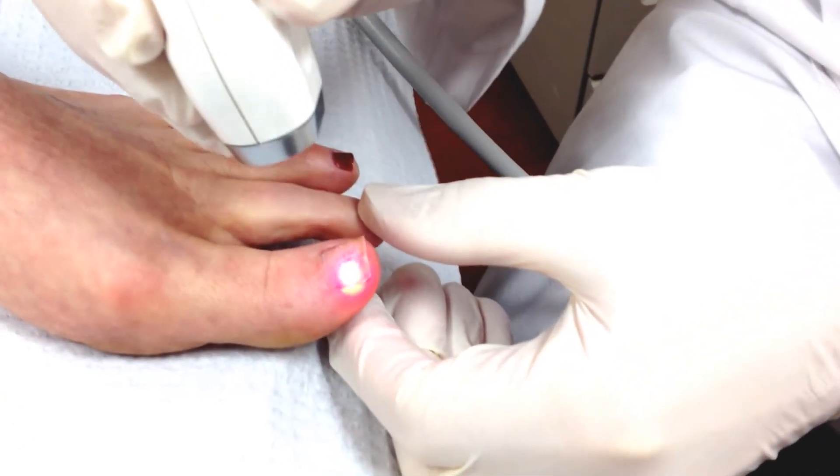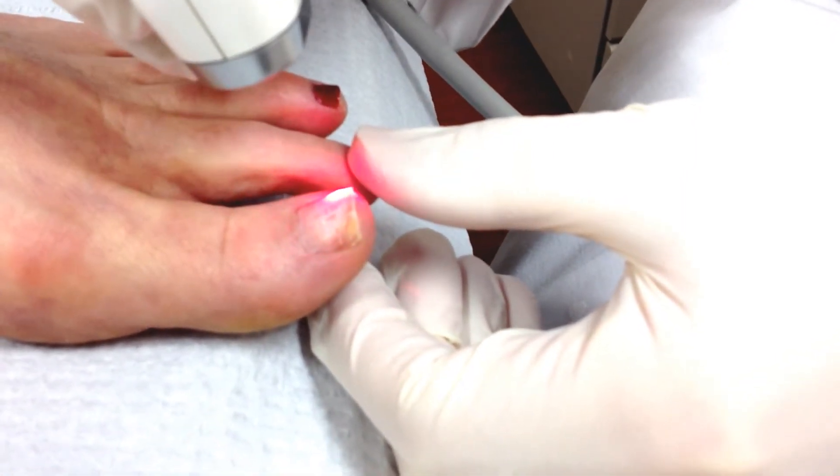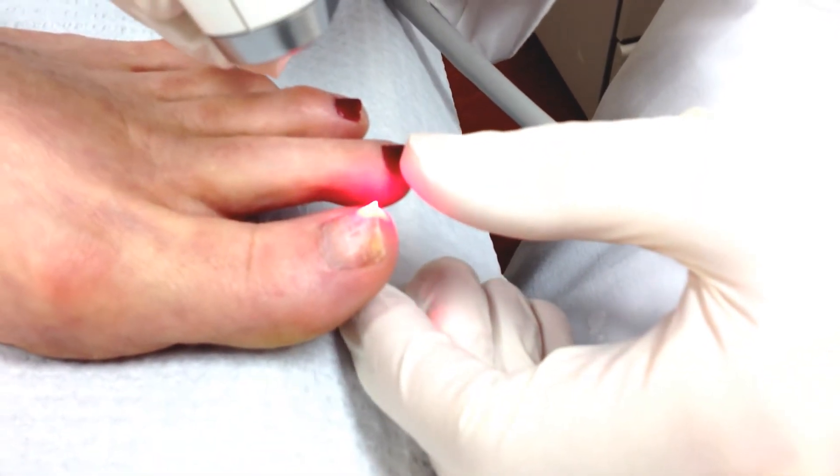The treatment is pretty tolerable. The nail gets warmer as we go, and the heat seems to disassociate or kill the fungus.